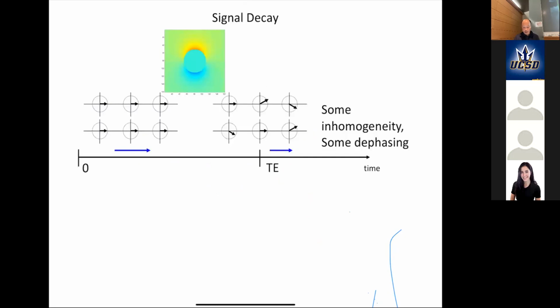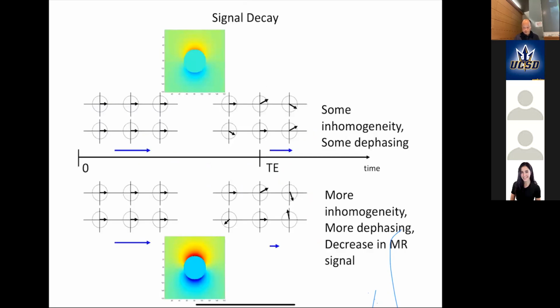So this is the picture we just looked at. The more inhomogeneity there is, the less signal there is. What we saw in the fMRI is that we went from a smaller signal to a bigger signal when they shine the light. So that must mean that when we shine light into someone's eyes and the visual cortex is active, we're going from a state with more inhomogeneity to a state with less inhomogeneity. That's the first thing we can conclude. It could have gone either way. A priori, people didn't know which way it was going to go, but it turns out it goes this way.